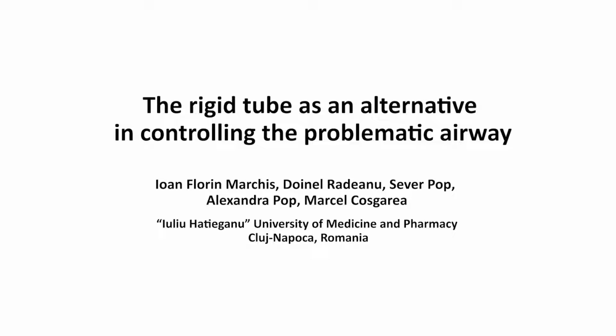This study aims to show that a cheap and straightforward tool, the rigid tube for laryngoscopy, could be efficiently used for tracheal intubation in patients with poor glottis visualization during conventional laryngoscopy.